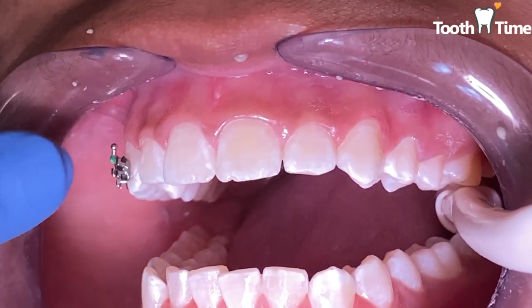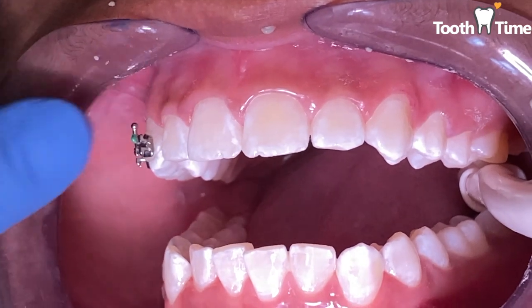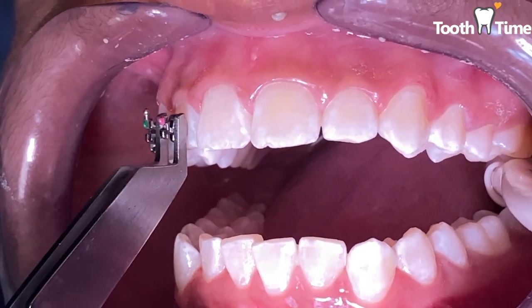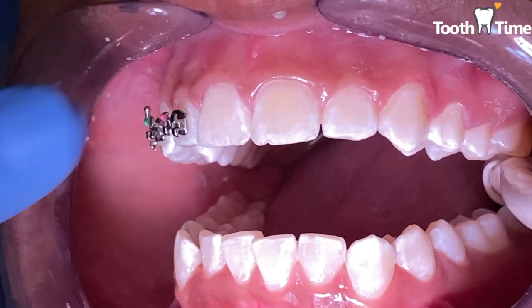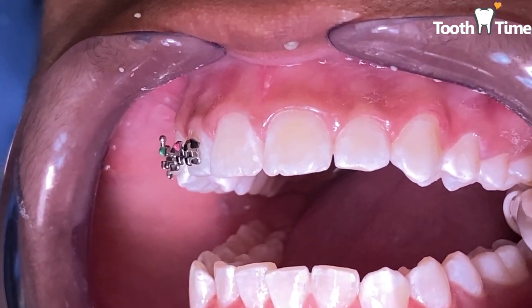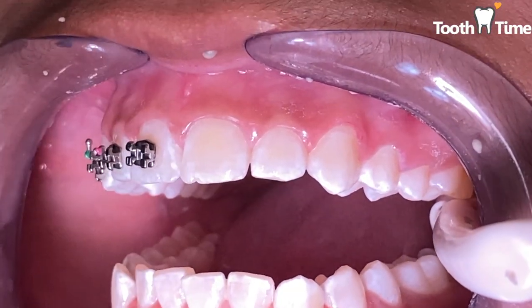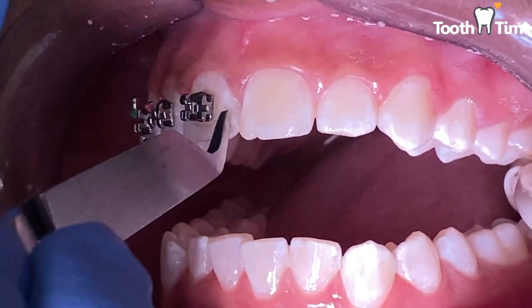We're going to go ahead and place the brackets. Once we've done that we're going to measure, and once we are done measuring we're going to cure the brackets with our blue curing light — our little bright blue light that we use.